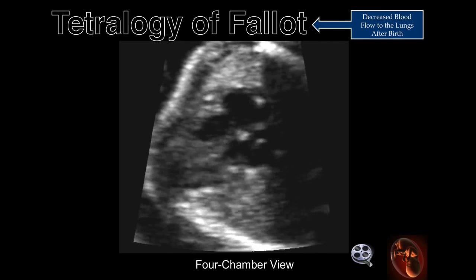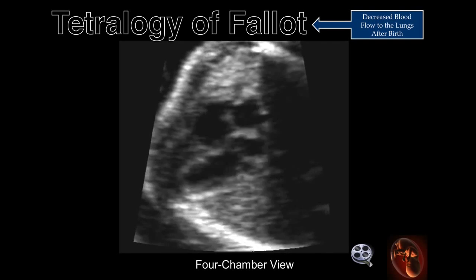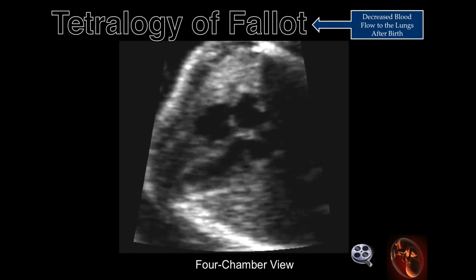This is a cine loop of the 4-chamber view. Notice there is no evidence of a hypertrophied right ventricular wall or ventricular septal defect.